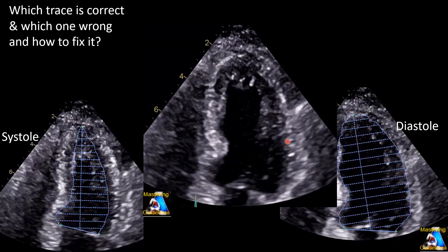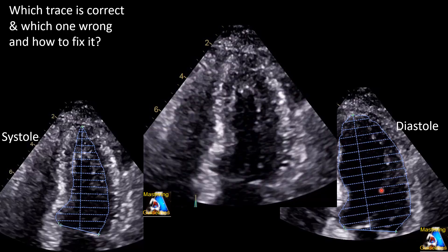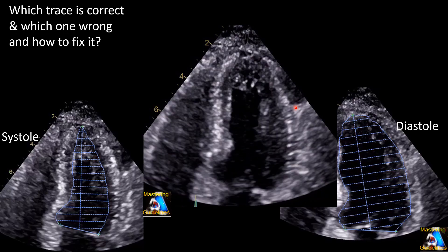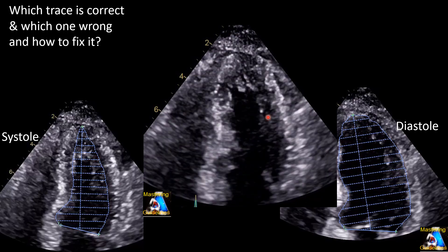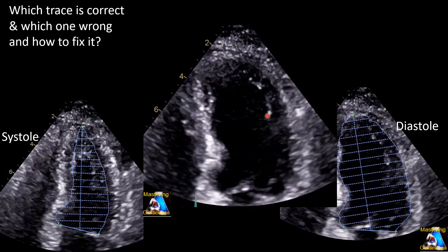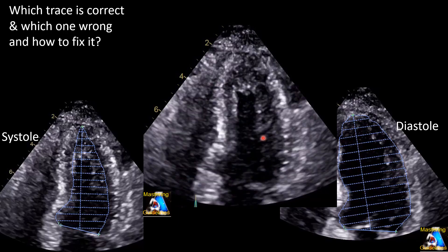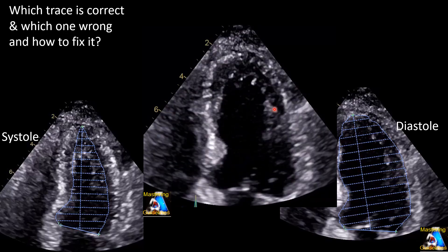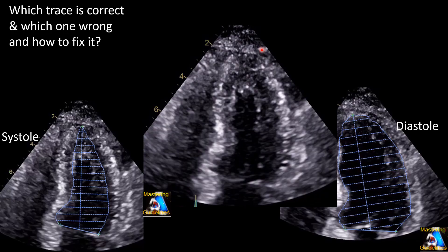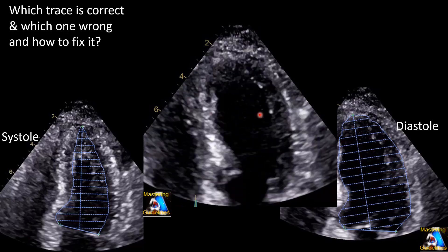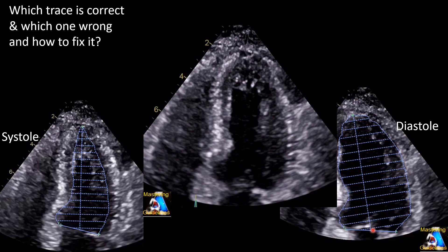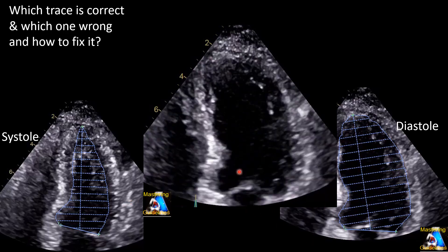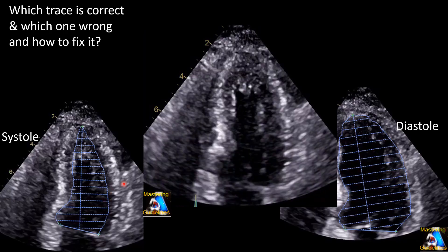Here we have another one — apical four-chamber, diastole and systole measured by the tech. It looks hyperdynamic. First, how can we make sure this is truly a hyperdynamic apical four-chamber view, or whether during systole we went off-axis giving that impression? Second, which tracing is not correct, and how can we fix it?